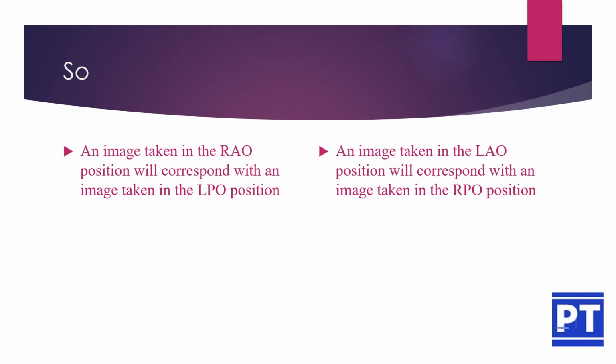An image taken in the right anterior oblique position will correspond with the image taken in the left posterior oblique position, and an image taken in the left anterior oblique position will correspond with the image taken in the right posterior oblique position. Hope you all have understood.